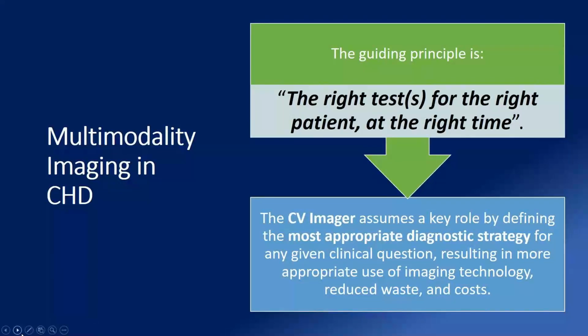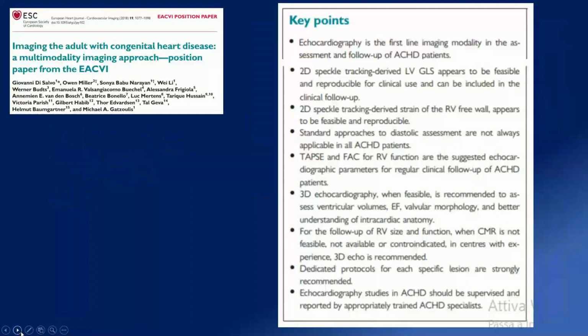In 2018, with the European Association of Cardiovascular Imaging, we produced a position paper about how to image the adult patient with congenital heart disease. And as confirmed also by this position paper, echocardiography is the first line imaging modality in assessment and in follow-up of ACHD patients.